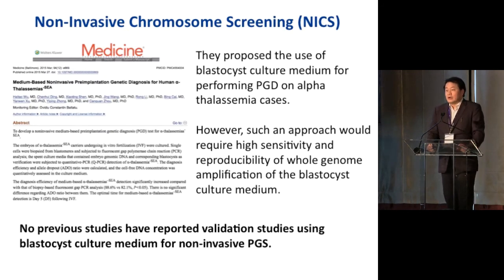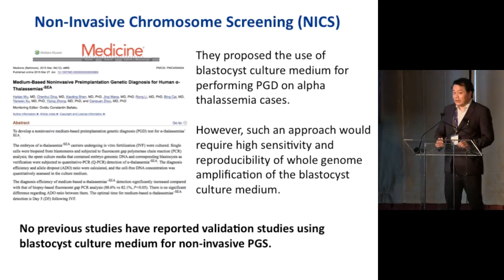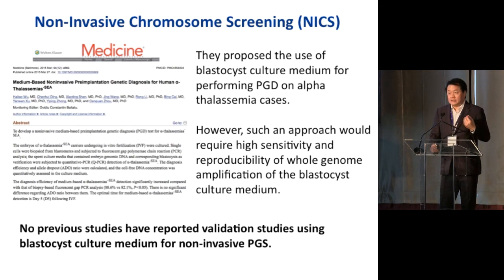So how do we do this non-invasively? The biopsy, no matter if it's at the polar body stage or the blastocyst stage on the 5th day, 6th day, is still damaging. So there have been reports about the detection of DNA in the spent culture media.